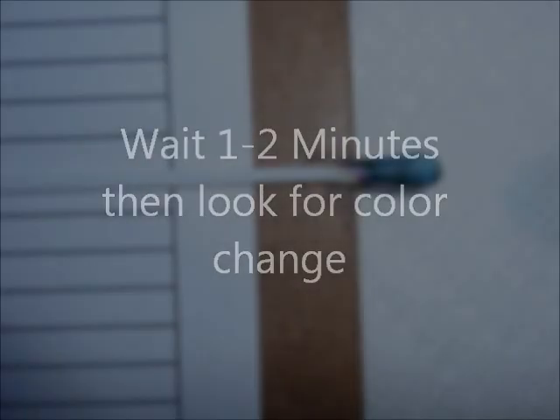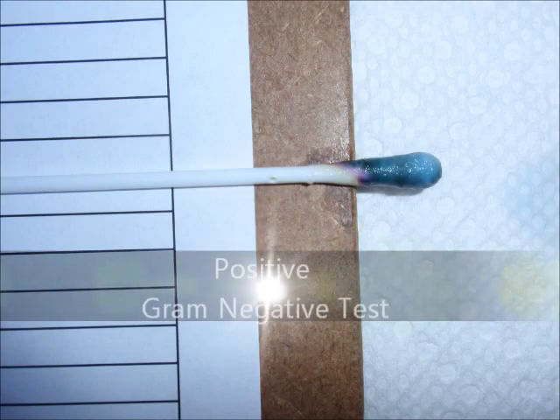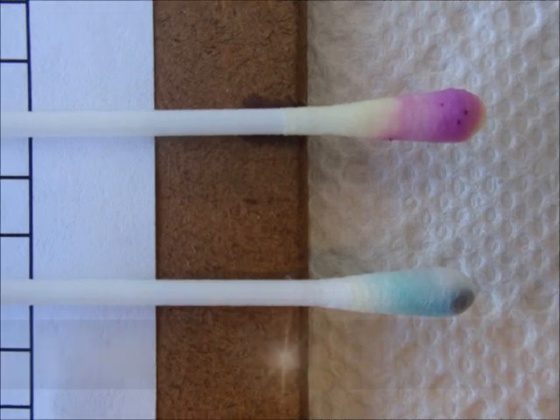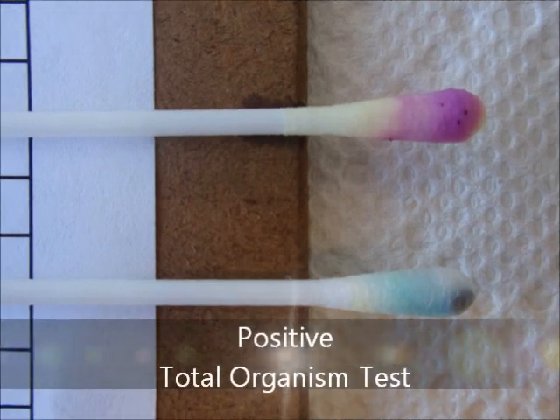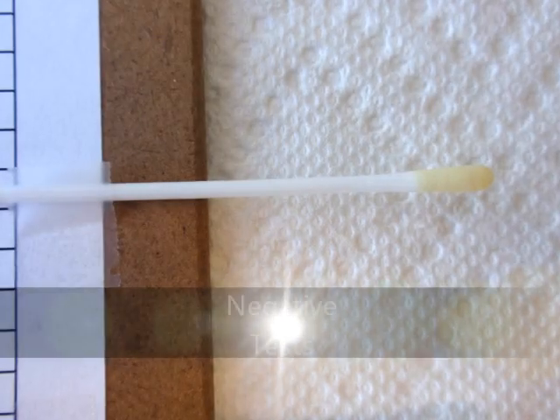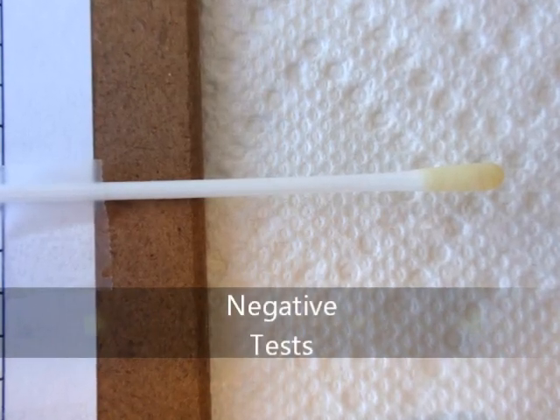When reagent C is added to the swab, wait one to two minutes and look at the swab tip for a color change. The gram-negative test, if positive, will have a blue color present, and the color will appear on the swab where the bacteria are located. The total organism test will have a purple color present, and occasionally a blue color on the swab if positive. If the test is negative, there will be no blue or purple color present.